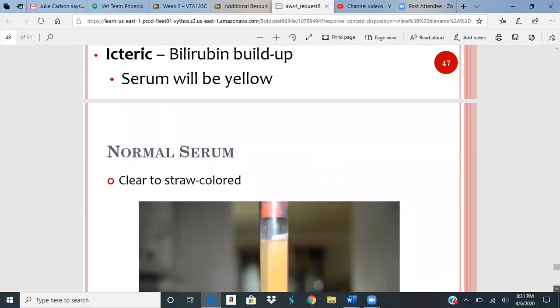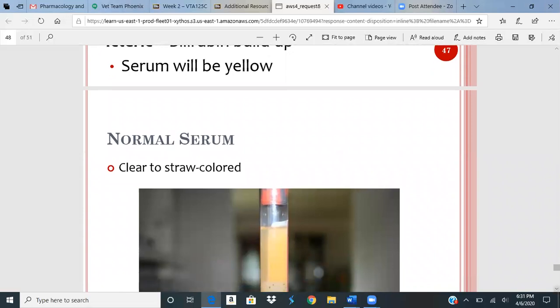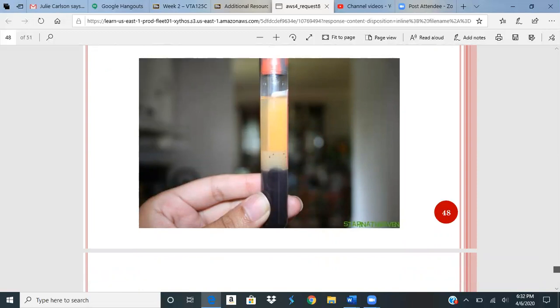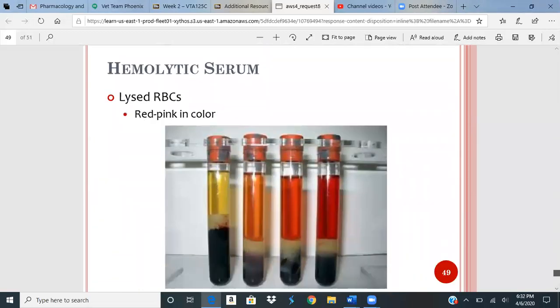So here's normal serum, at least what it's supposed to look like. That's a serum separator top or tiger top tube. Here's the red blood cells. Here's your clot, I'm sorry, your gel. And then here's your serum at the top. That's what it's supposed to look like. Hemolytic serum. Here it's trying to show you normal, and then the red is, again, where we've lysed those red blood cells.